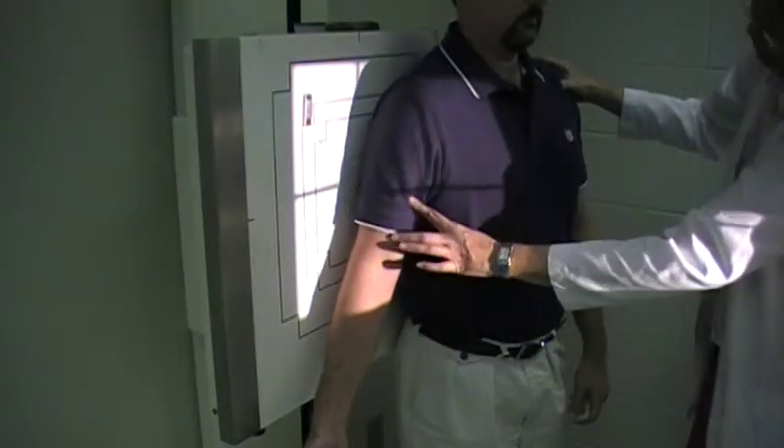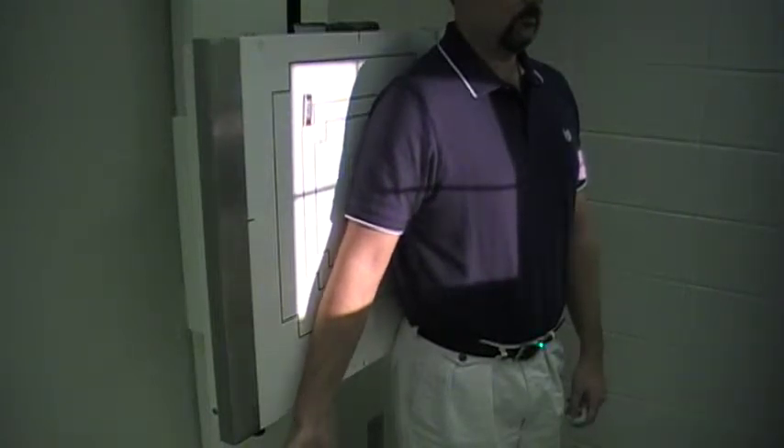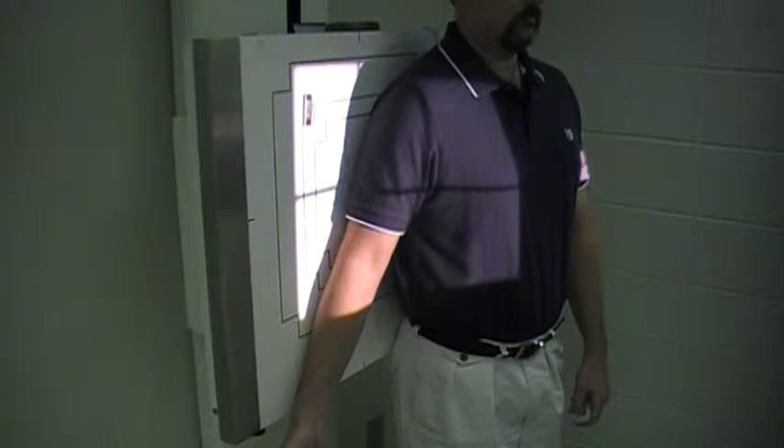Your central ray is going to be mid-humerus. We are using a 14 by 17 or a 35 by 43 image receptor.